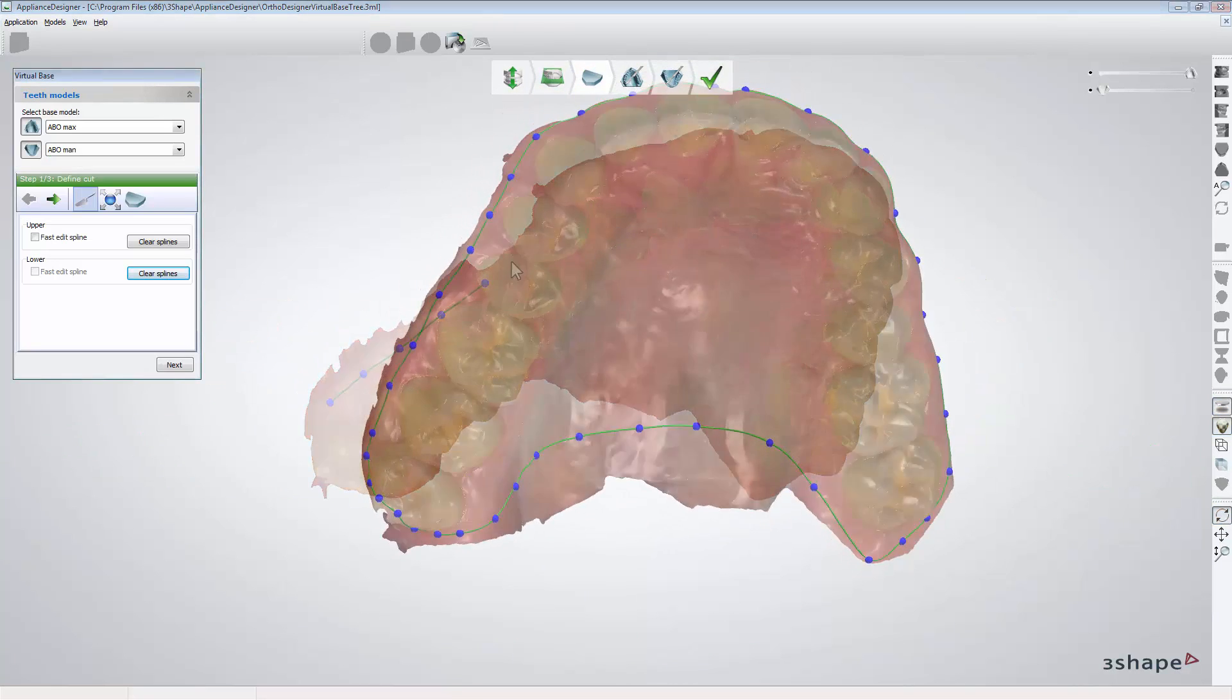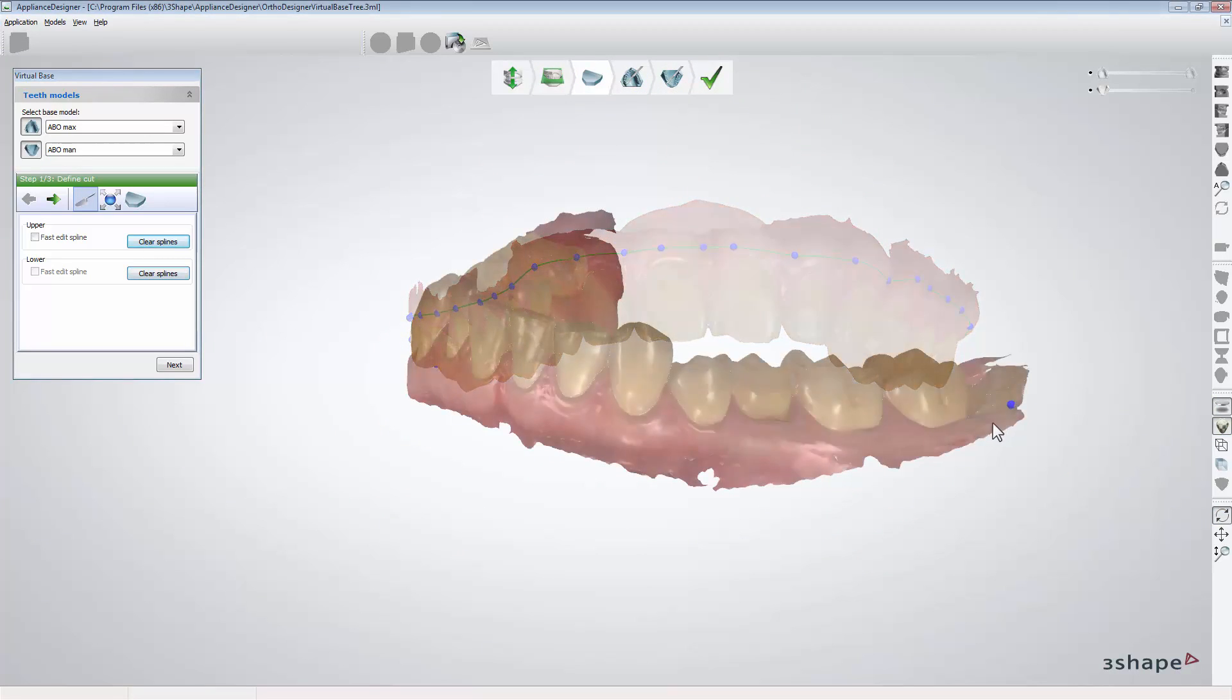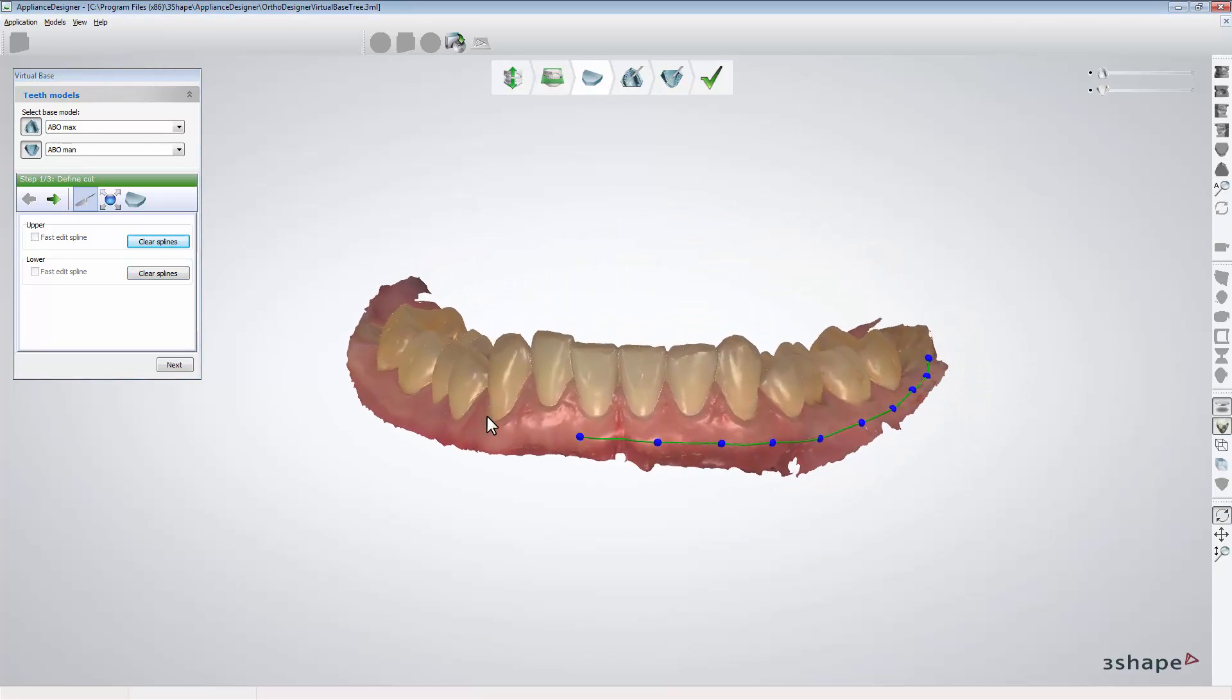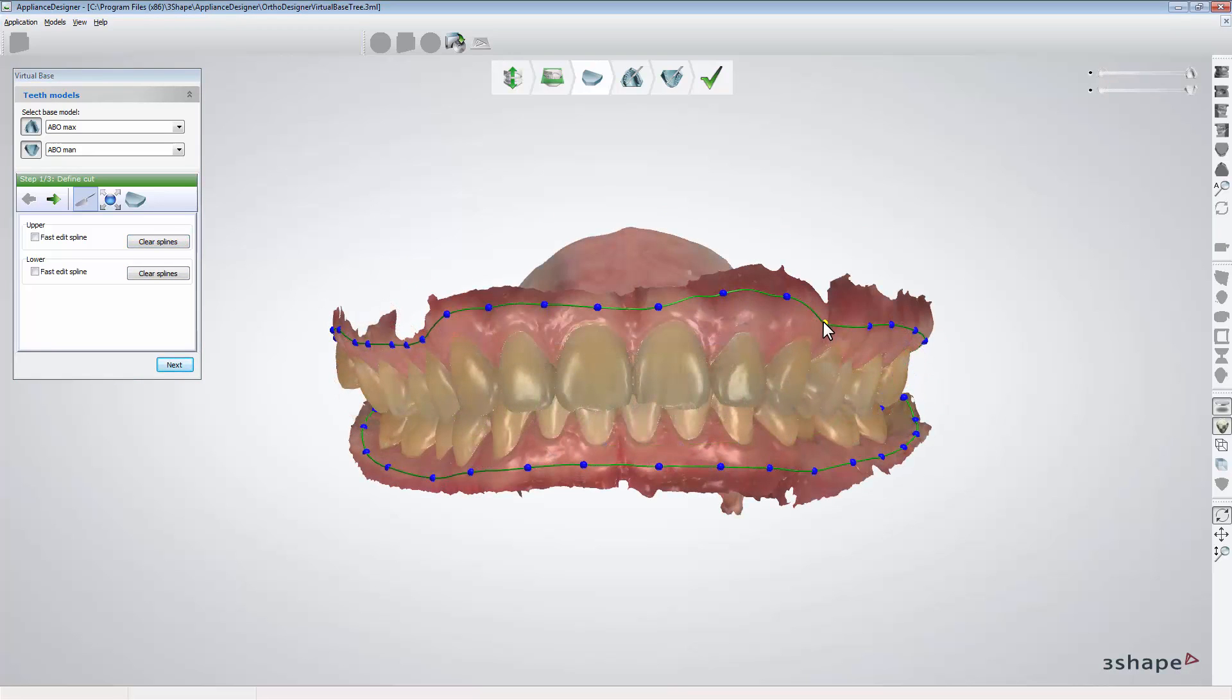Now you can create a virtual base. First trim both scans by drawing splines. Once splines are closed you can adjust their shape.